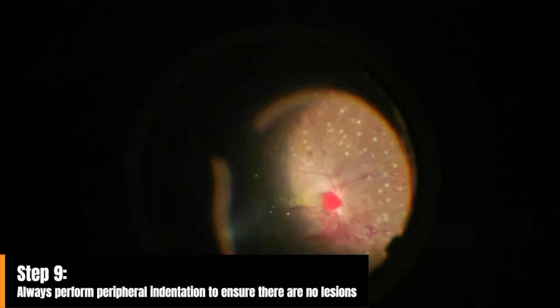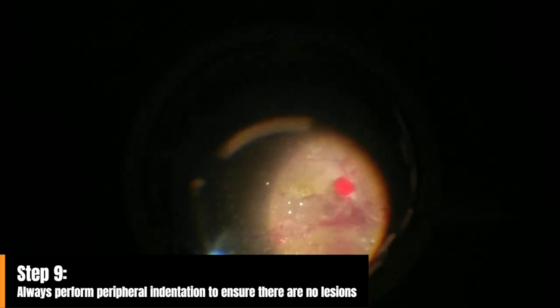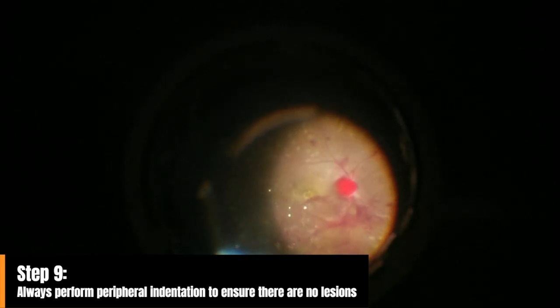I know this wasn't a direct tractional retinal detachment, but you manipulated and pulled the hyaloid significantly, so it's not unusual to cause a tear or injury in the periphery. Always make sure to perform a thorough indentation.